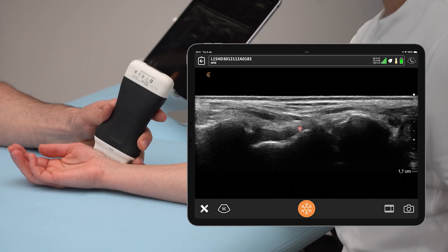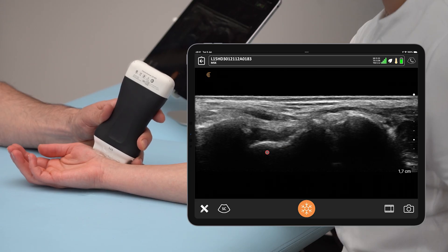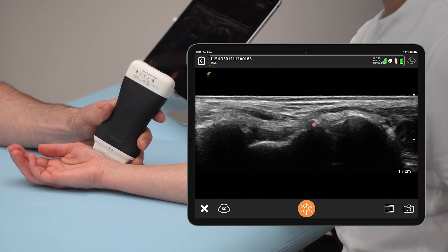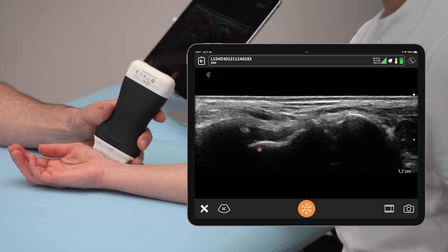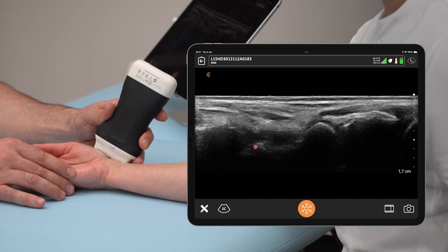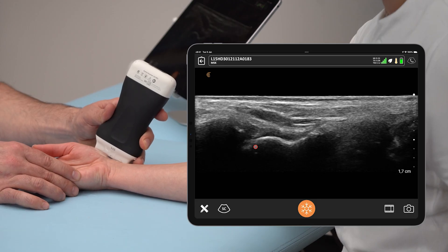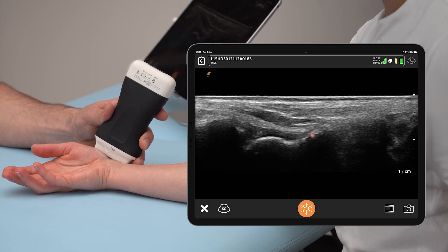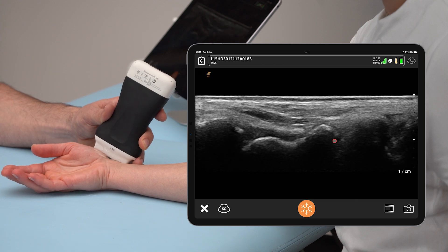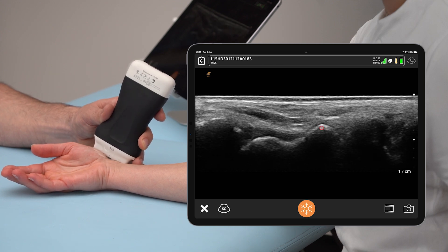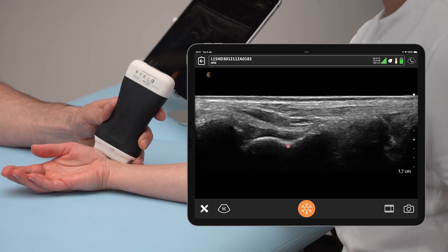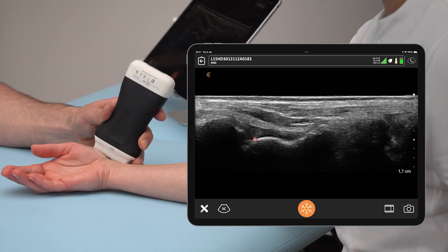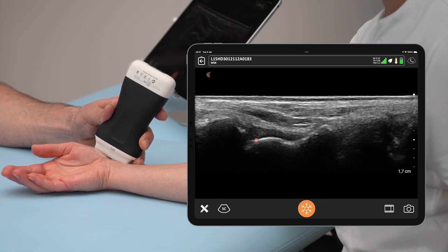On the palmar side, the scaphoid bone can be seen right here — it has a little bit of a peanut shape, as it is called in the literature. When the patient makes an ulnar deviation, we can suddenly see much more of this peanut-shaped scaphoid bone. We observe every part of the scaphoid, going down this convexity and concavity, searching for step deformities.